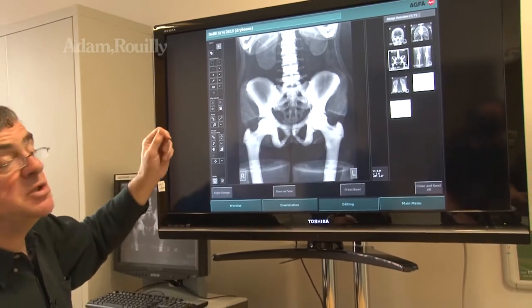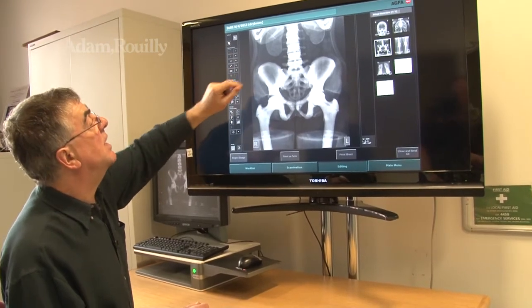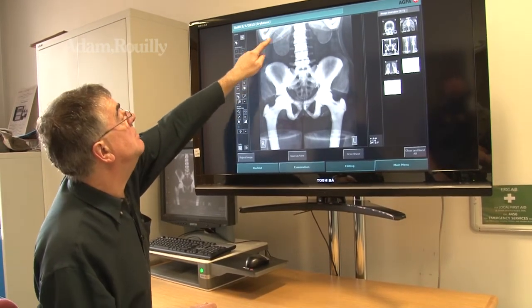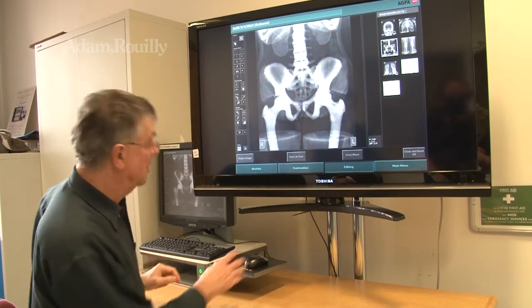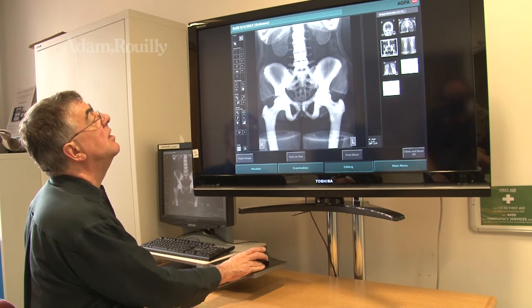But of course, the other thing is to make sure I've got overlap correct, because as you know, I've done a chest X-ray beforehand. So to prove that I've got the overlap, here is the lower part of the rib cage. I'll just also show there and there. And there's the kidney, there.